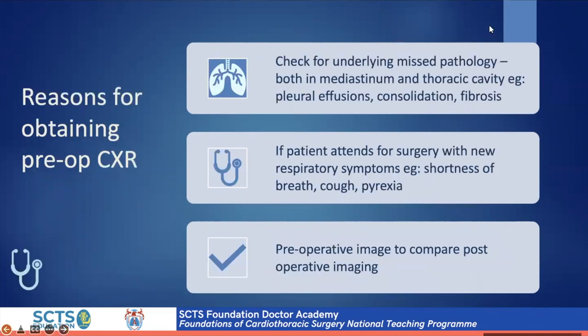Okay. So some of the reasons that we obtain a preoperative chest X-ray include checking for missed underlying pathologies in the thoracic cavity, looking at the pleura, the lungs, and the mediastinum as well. If a patient attends for surgery preoperatively with new symptoms such as shortness of breath, cough, hemoptysis, or evidence of pyrexia, it's also important that we gain a preoperative image in order to compare when we have postoperative imaging.